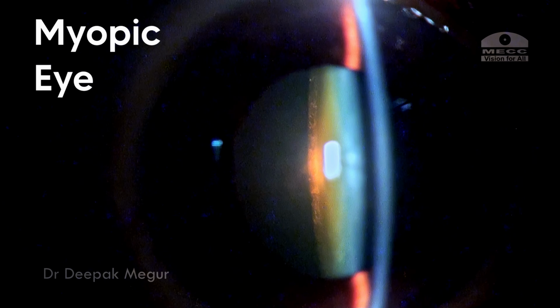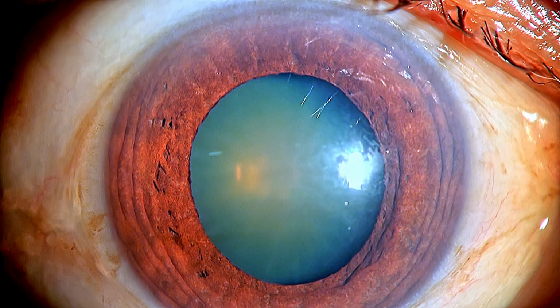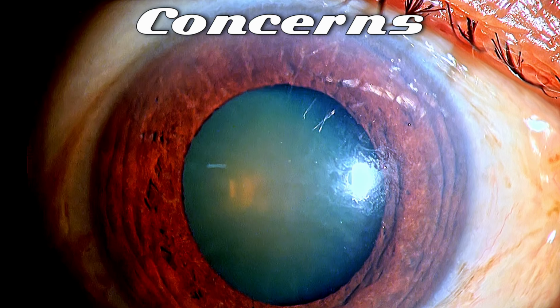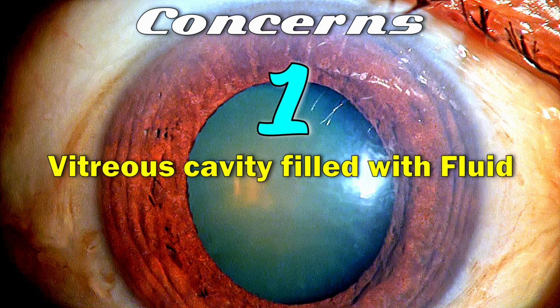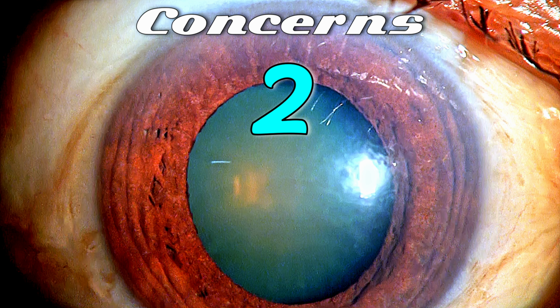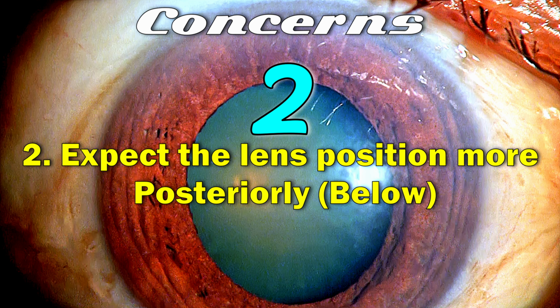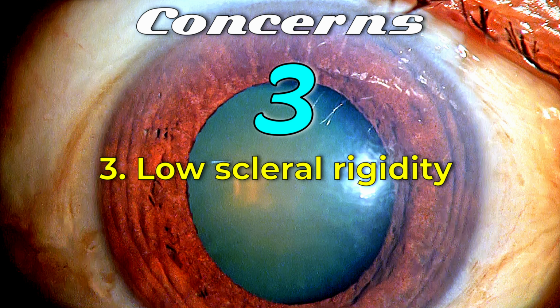This patient is also myopic, and for which he developed a retinal detachment. So in such an eye, there are a few concerns when you're going to do cataract surgeries. Number one would be that this vitreous cavity is filled with just fluid and we don't have the vitreous gel. So the gel support which is given to the eye is not there, and along with that, the patient is also slightly myopic. So in these vitrectomized eyes, we expect that the lens is positioned slightly below, and because of the coexisting myopia as well, there's always a possibility of a low scleral rigidity.